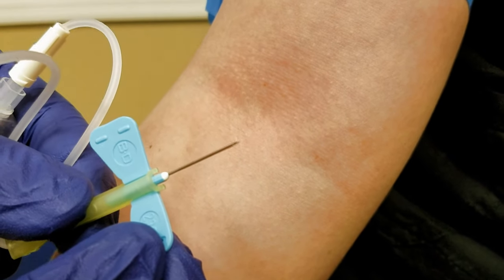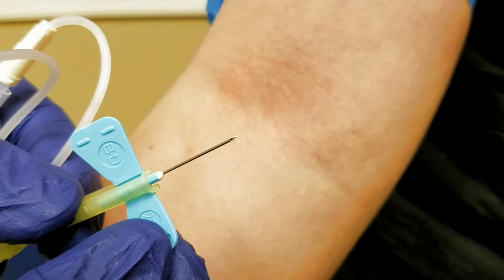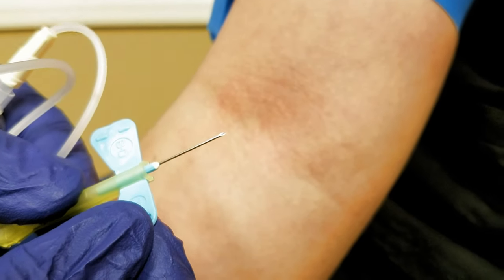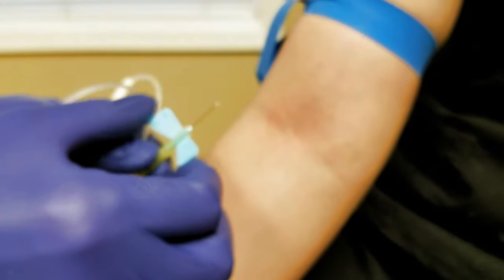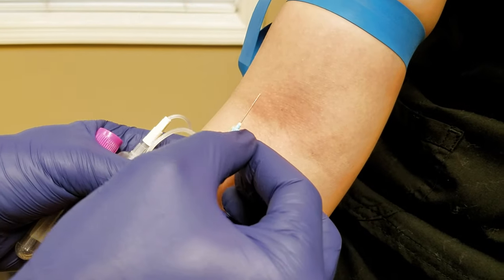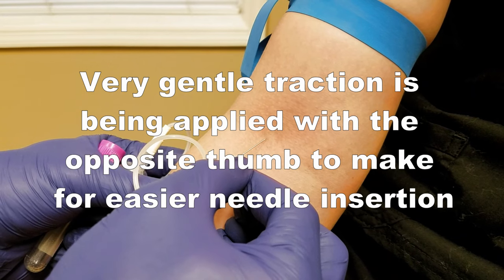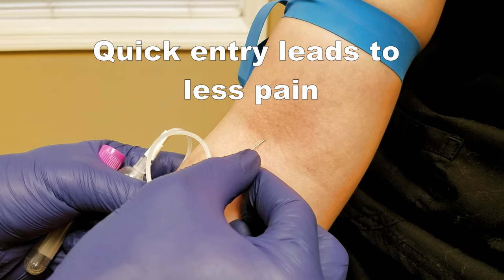There you see the shiny part of the needle — that's the bevel. You want to make sure it's pointed up. Then we get right to where we know the vein is and go one, two, three — quickly go through the skin.